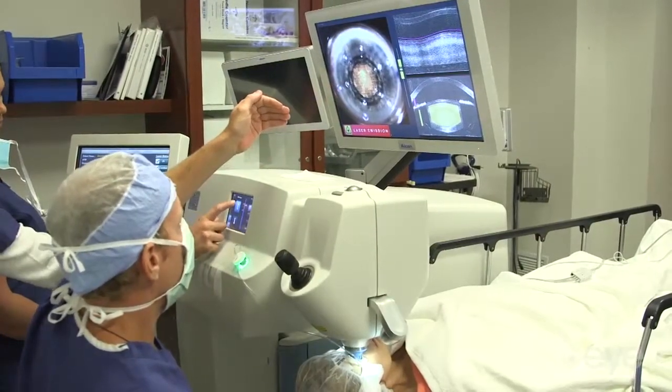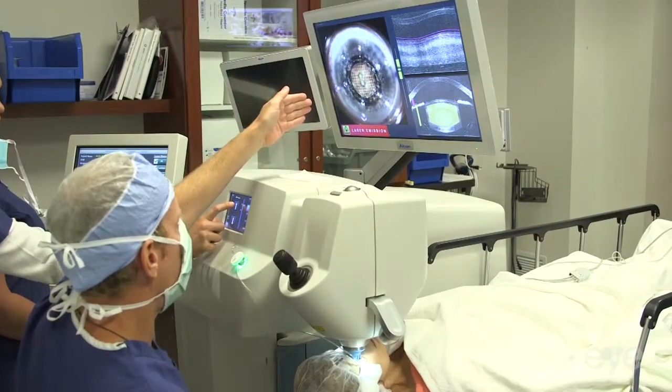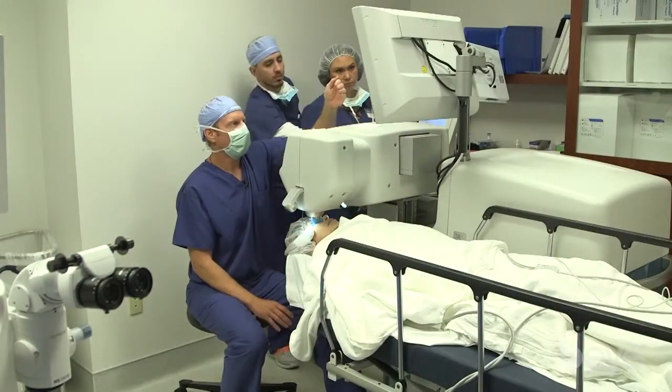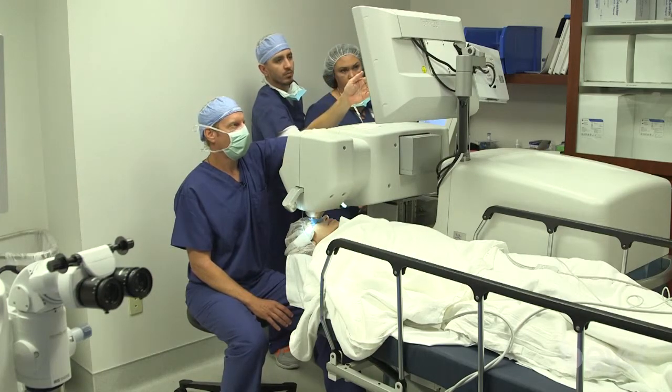The LensX laser is probably the fastest laser that I have, and if speed is of utmost importance, the LensX laser is extremely fast. It's probably the easiest to use for the surgeon to control, and what I'm drawn to about the LensX is that I can control everything on the software myself because there's a mouse and button right in front of me. It saves time for me to be clicking on the different software applications and repositioning anything that needs to be repositioned myself, with little time delay or communication needed from an assistant. That's a very nice feature of this particular laser.